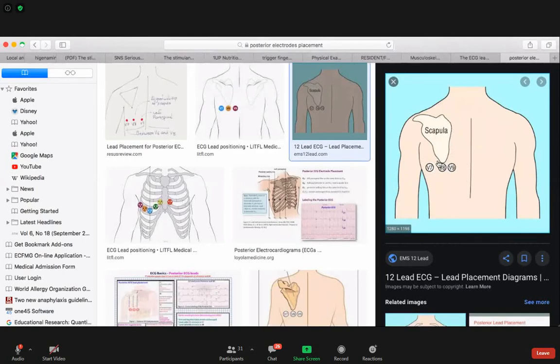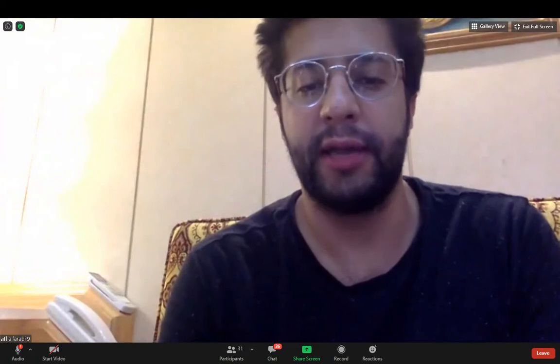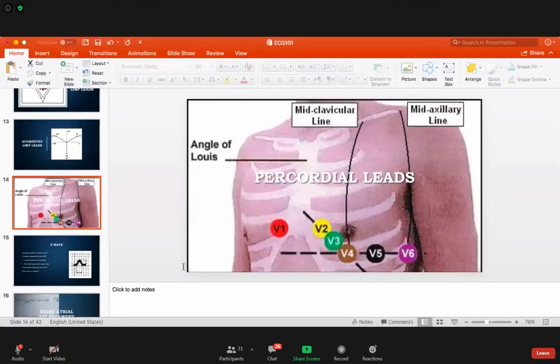Of course, when you move V4 and V3, you call them V4R and V3R. How do you call them in the ECG? Okay, but these are not important, because somebody asked, so I'm going to explain it. I want you to understand how to do 12 leads for now. That's clear? So let's move on.